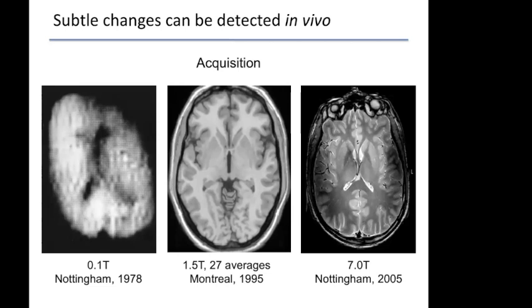Yeah. And then maybe one last question. That's more for structural. What if you would go for resting state fMRI, for example? I thought there would be a lot of noise that you would have to remove from that. Would you be scared to do rest? Yeah, but I think where people benefit a lot is those trying to push the limits of the scanner, like laminar fMRI or something like that.